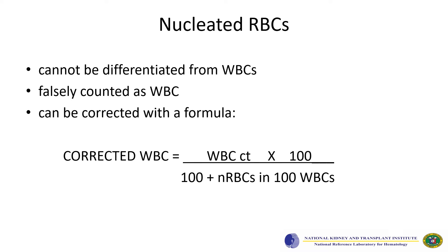The presence of a significant number of nucleated RBCs should be corrected because they cannot be differentiated from WBCs and could falsely be counted as WBCs. This can be corrected with a formula: corrected WBCs equals the WBC count multiplied by 100, divided by 100 plus the number of NRBCs per 100 WBCs obtained in the differential count.